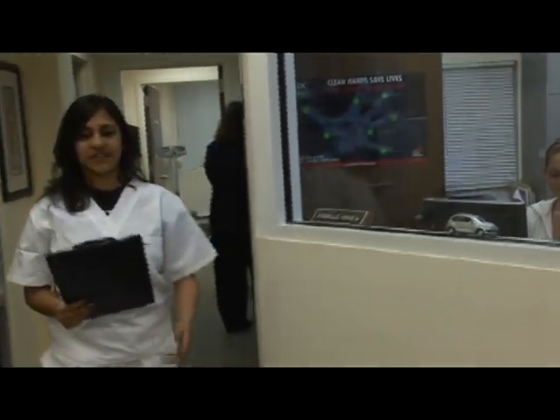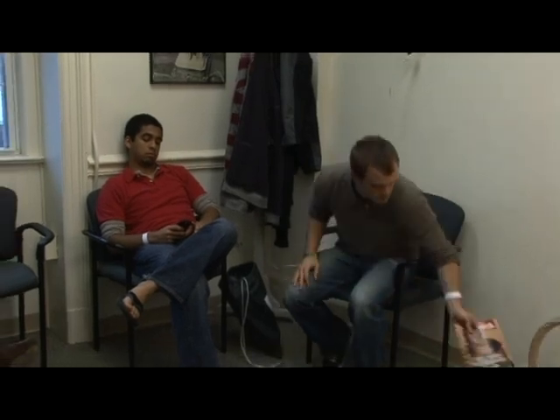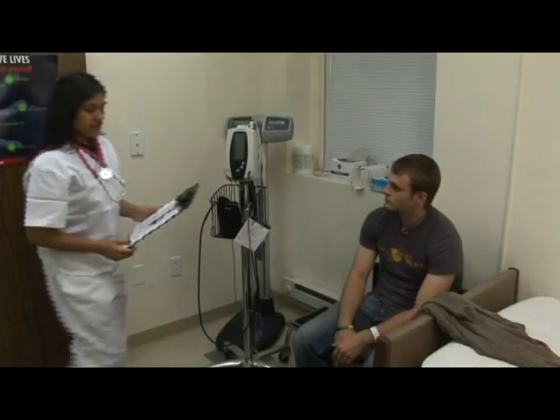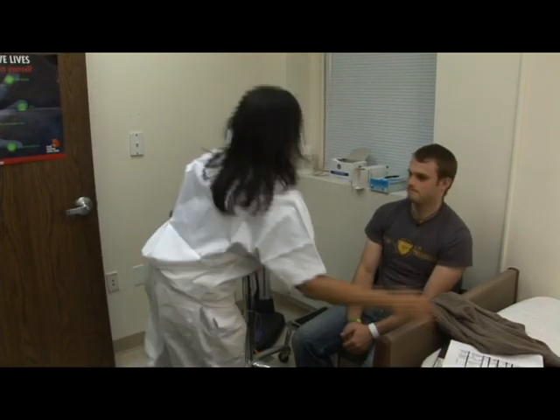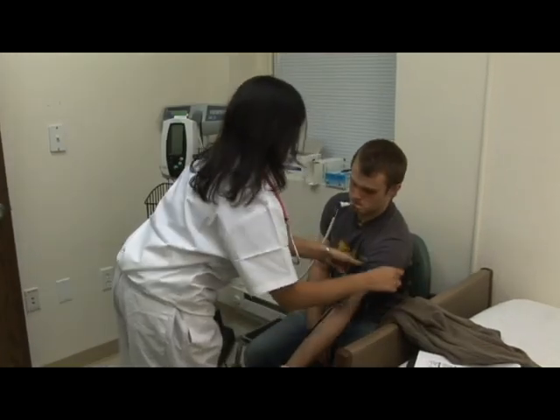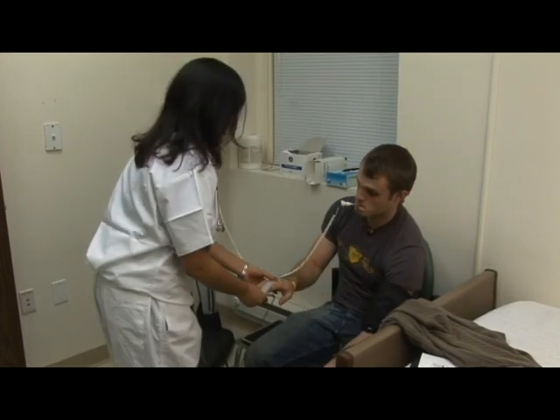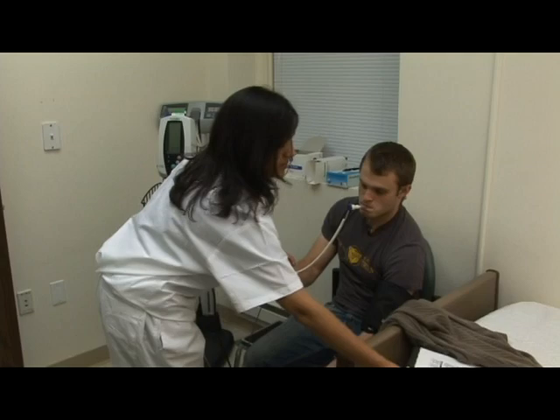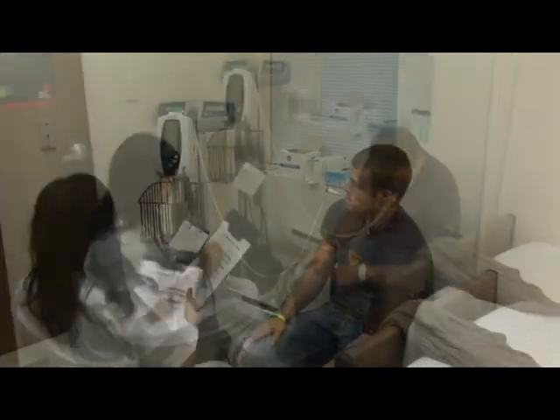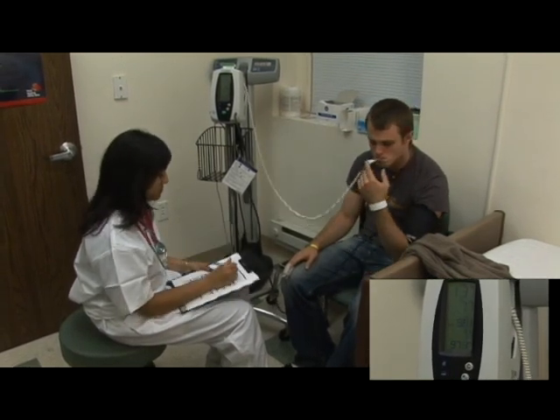Triage is often performed in a designated room in the emergency department. Following the wait, the triage nurse records patient vital signs, which are temperature, blood pressure, heart rate, blood oxygen saturation, and respiration rate. No current vital sign monitor is capable of automatic respiratory rate spot checking, and most require manual documentation of recorded vital signs.